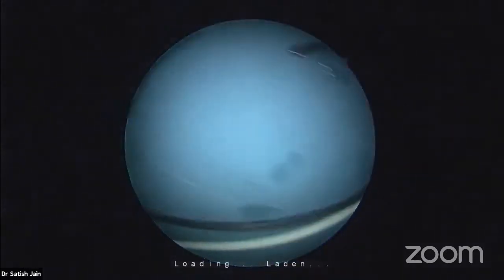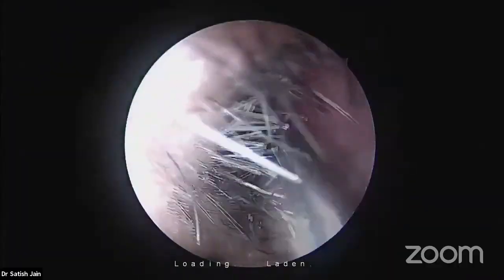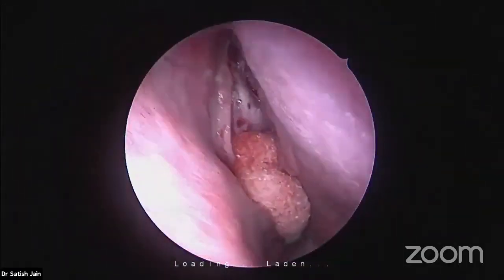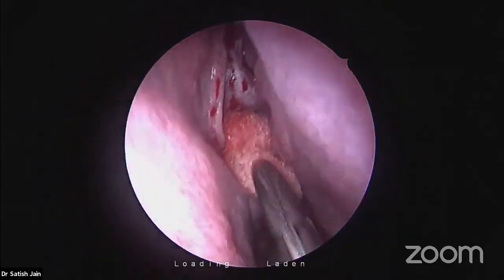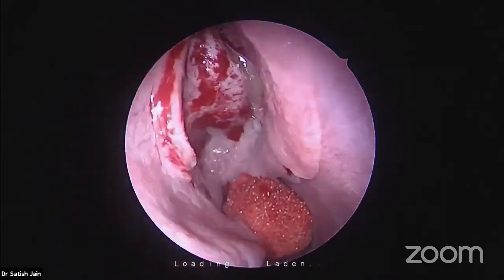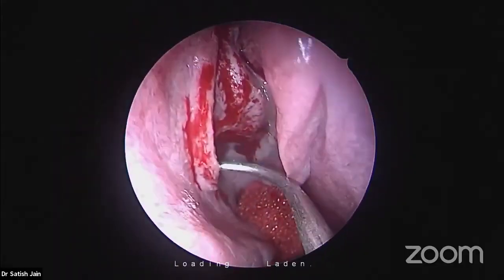And second is for non-sinus surgery, as an approach to go behind. In a regular situation, not having massive mucosal disease, not having massive eosinophilic disease, there is no point in creating a mega antrostomy. That is the perfect way of defining the need of mega antrostomy, I believe.